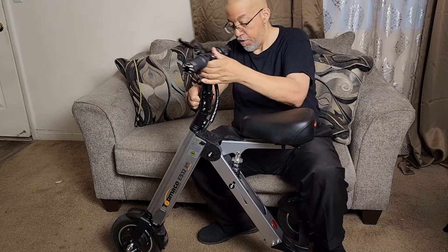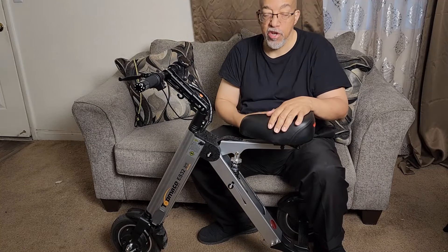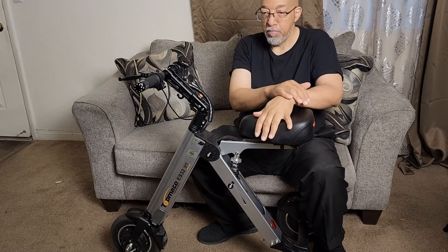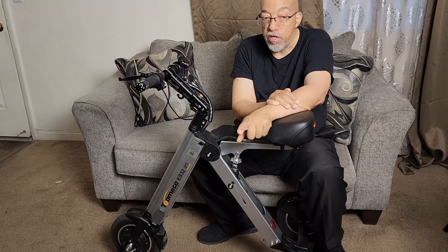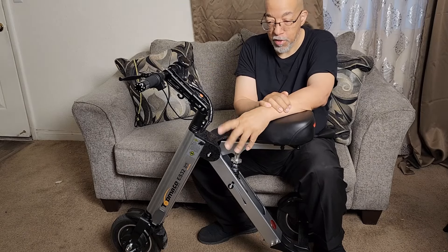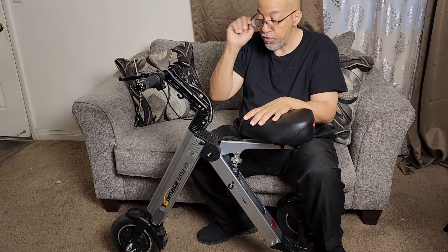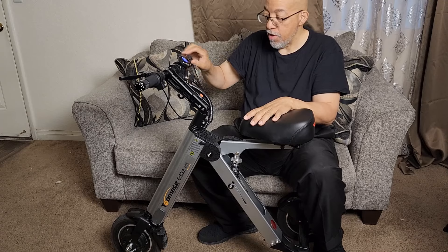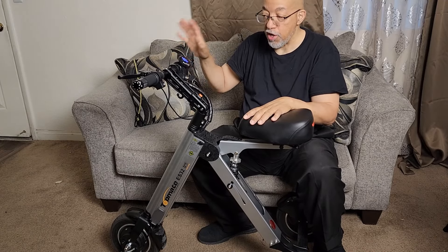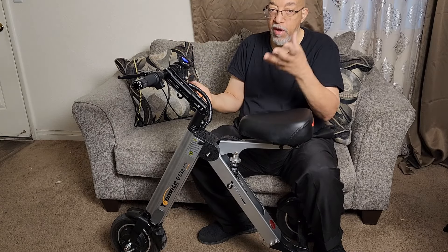Nice, sturdy seat. It gets up to about 15 miles an hour — I haven't taken it that fast because we have some balance issues, but using this actually made my balance better because it makes me balance on it. It has three wheels, so it's a lot easier to balance on, and it moves pretty quickly if you turn it on and hit it just once. Automatic — it jumps right into gear.